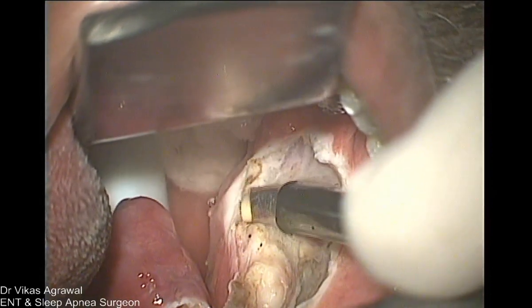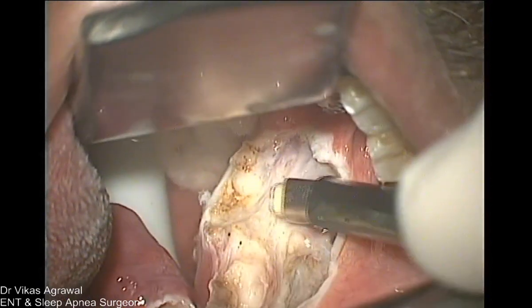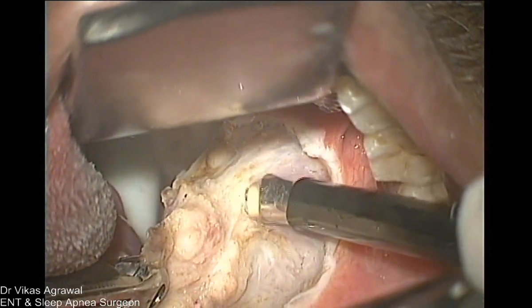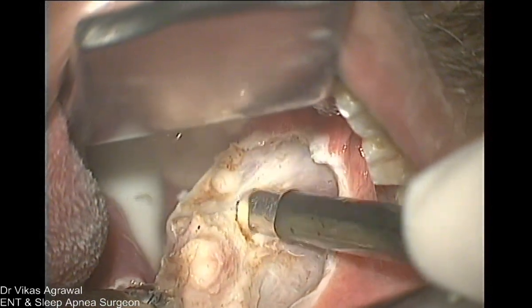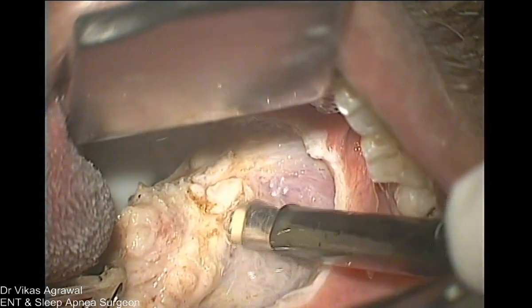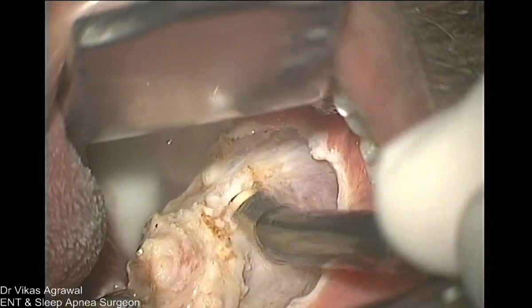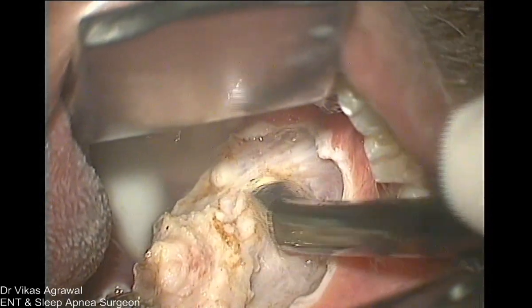This is intracapsular dissection into the lower pole, because the lower pole of the tonsil doesn't really cause sleep apnea. This is the lower pole of the tonsil, which I am purposely leaving behind.